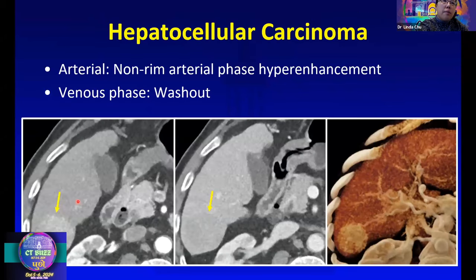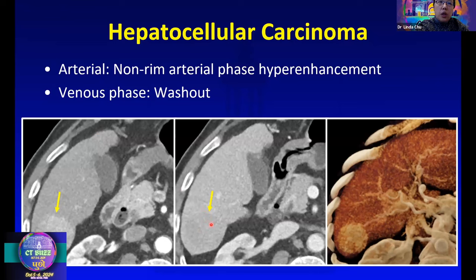Here's a classic example of a hepatocellular carcinoma. You can appreciate arterial phase hyper-enhancement of this mass in the nodular liver — an enhancing mass in the cirrhotic liver should always raise concern for HCC. On the venous phase images, you can appreciate subtle washout, because the mass is now enhancing less than the background liver. The cinematic images help accentuate the conspicuity of the mass, which was not that obvious on routine images.